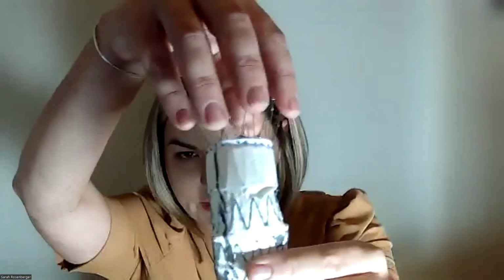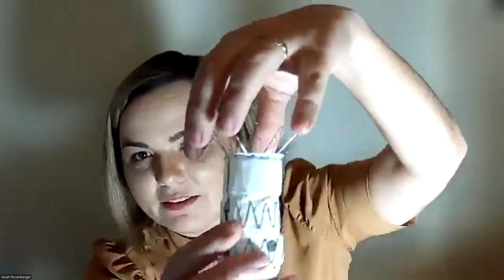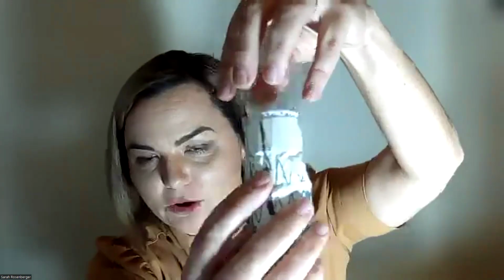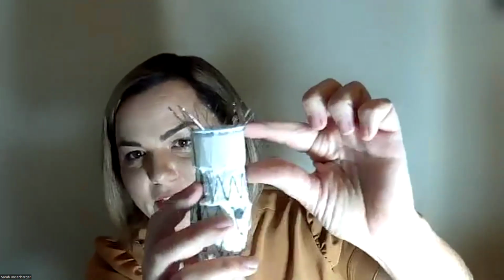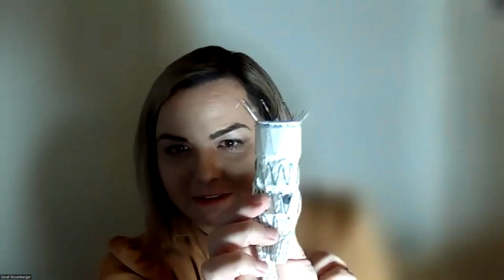Some of these EVAR stent grafts have fixation above the stent graft. So this part is meant to hook into and hold to the aorta, but then this part is the part that has to hold, that starts pushing up against the wall with radial force.